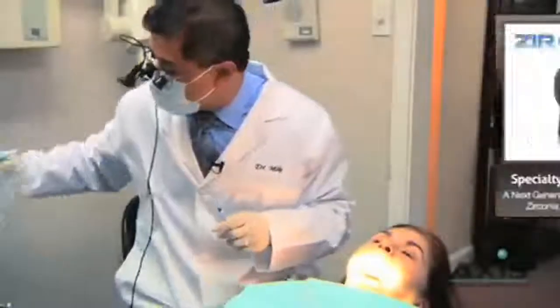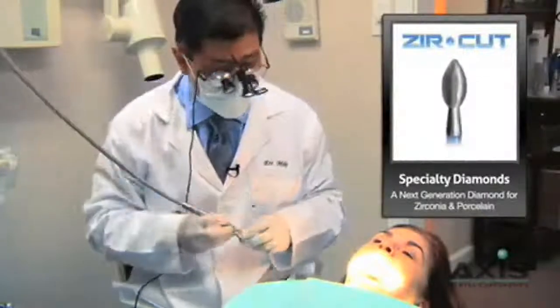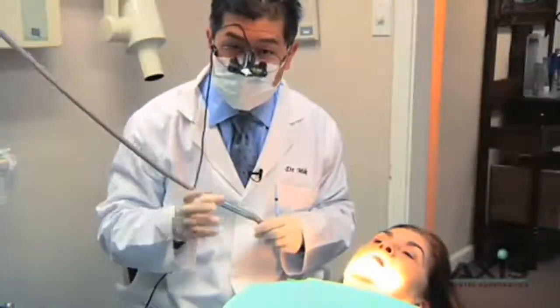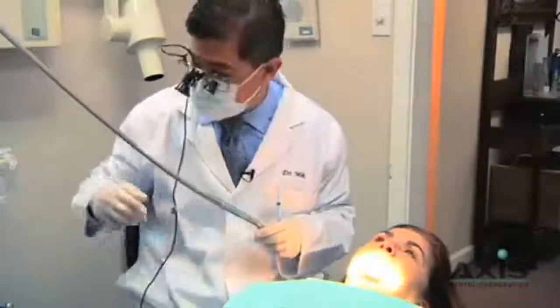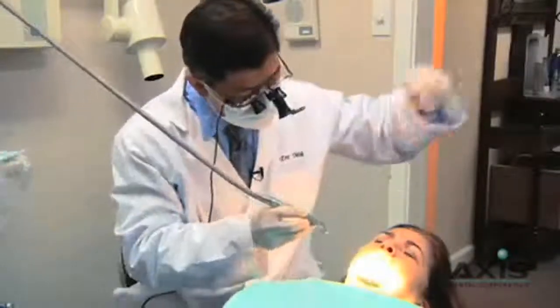We'll come in with our Zurcut diamonds, which are very nice to adjust porcelain because they don't introduce any micro-fractures. One of the key things is we don't want to introduce a lot of heat to porcelain, because porcelain can then develop micro-fractures. So we'll use a little bit of water, a little bit of suction, and just do some adjusting.